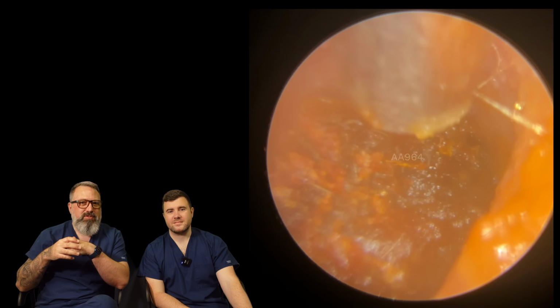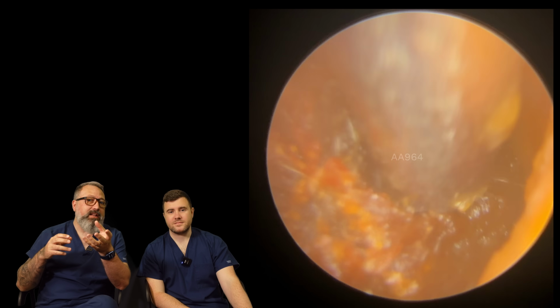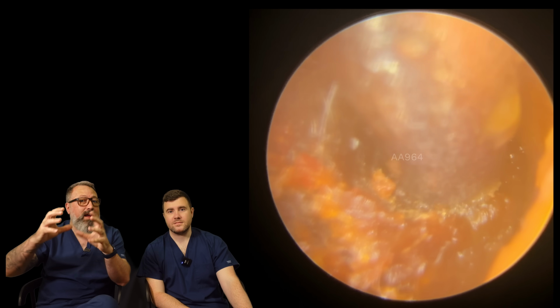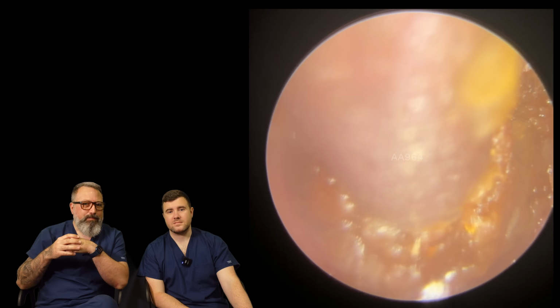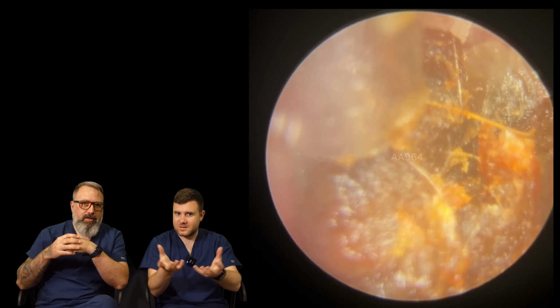It's just never easy ones to do. And when they are hanging on and really sticky like this, the wax hangs on to that epithelial layer that's wrapping around it. That epithelial layer is hanging onto the canal wall, so there's just no gap, and it just doesn't want to come away very easily. So that's where the oil helps to get underneath that, so it slides. You got it. A lot easier.